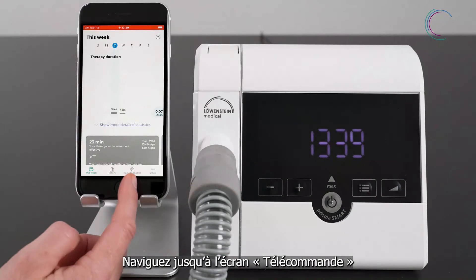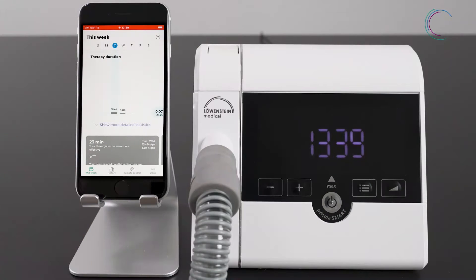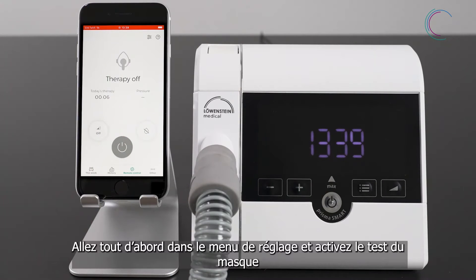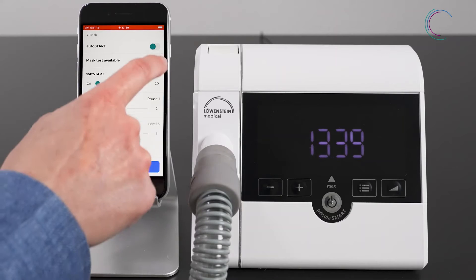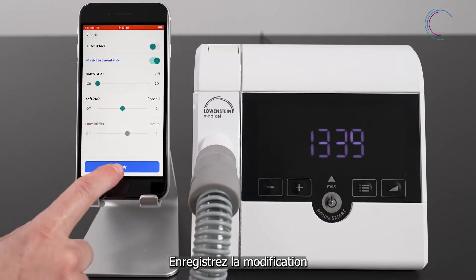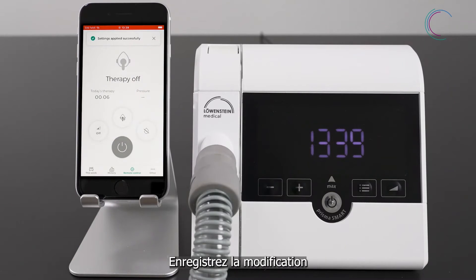Go to remote control. To activate the mask test, go to the settings. Here you can activate the mask test. Apply your setting changes.